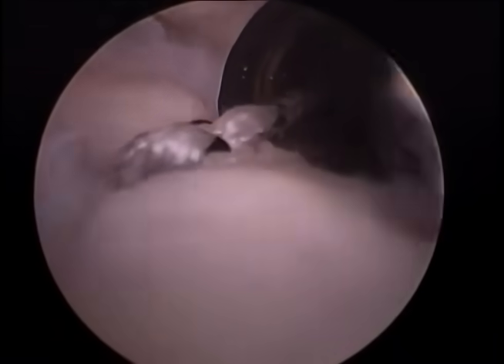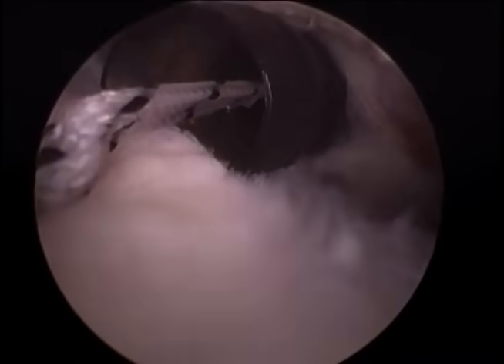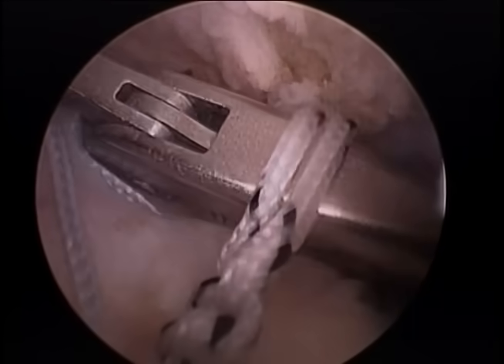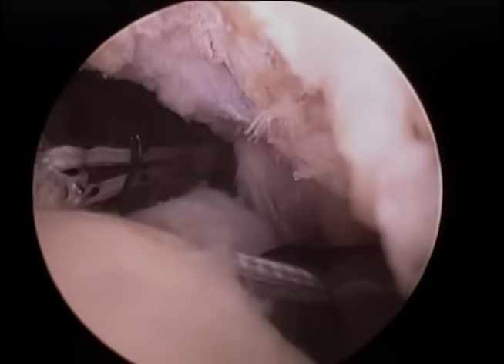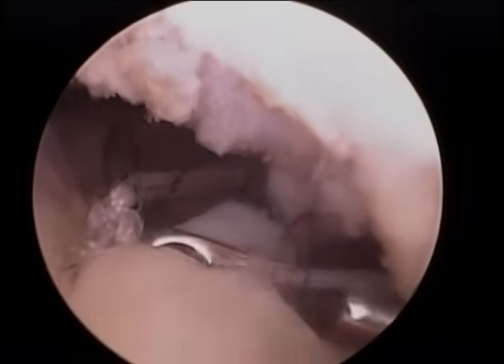When we are complete, we retrieve our blue sutures, as we have now placed the white sutures in another cannula to prevent tangling. Once we have pulled these sutures outside the body, we again tie our same knot. You see our knot pusher sliding the suture down to cinch the knot down firmly, which is quite important.